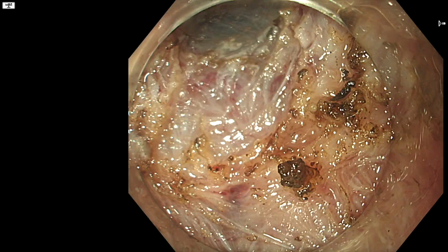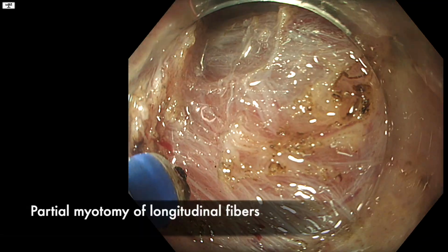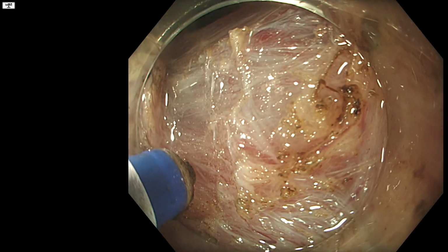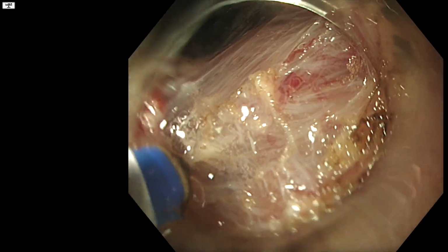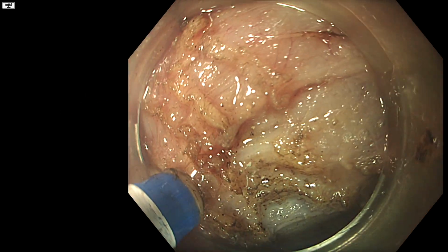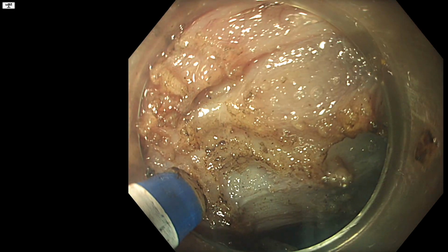As we advance, as you can see, we're having to sacrifice some of the longitudinal muscle fibers as well, so it's a partial myotomy to free up the lesion. But notice that we're doing this carefully. We're trying to see clearly each fiber that we cut, and the goal is to complete the resection without actually breaching into the pararectal fat or creating a full thickness defect.